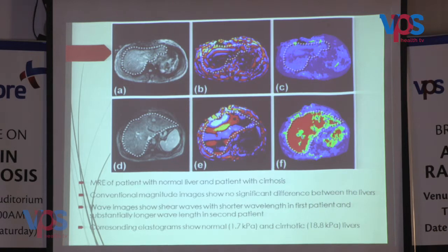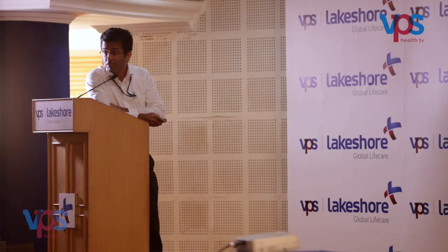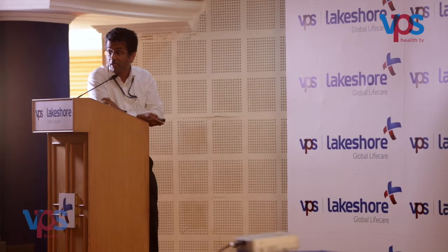So these are some images. MR elastography of a patient with a normal liver and a patient with cirrhosis. On your top, you have a patient with a normal liver. You can see that the stiffness is normal. It is towards the left-hand side of the color map, if you remember the color map I showed you. While on the lower set of images, you can see that the liver is very stiff. This is a cirrhotic liver. But mind you, look at the morphology. The liver morphology has not really changed that much. So if you were to just look at it on an ultrasound or a CT or an MR without elastography, you would think the liver is morphologically normal. While it is not, the liver is stiff, the liver is cirrhotic, just picked up by MR elastography.